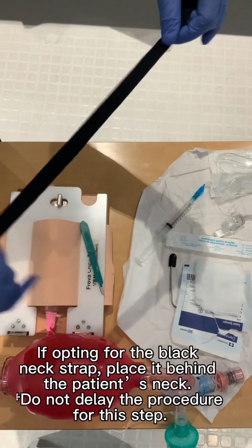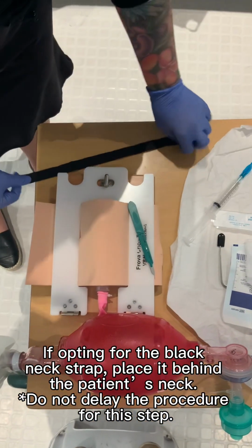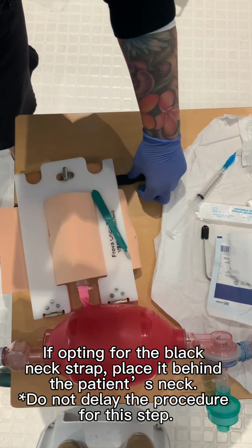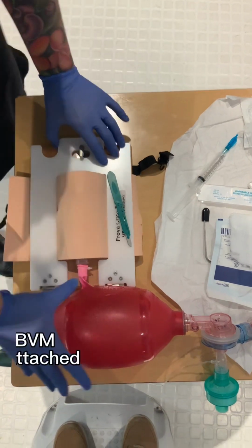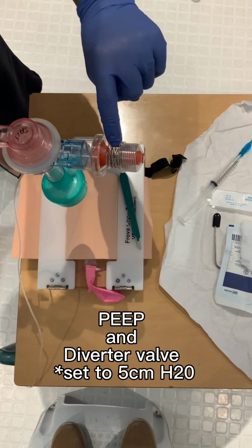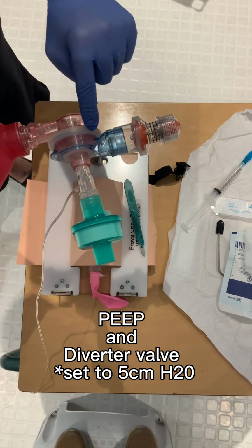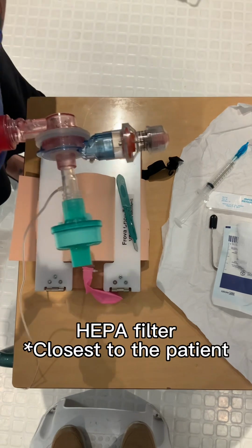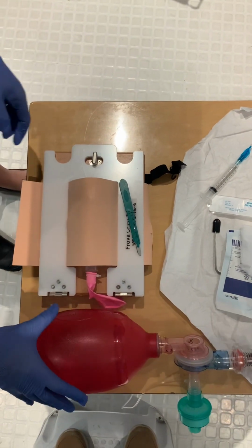A second option to tie the ETT down is the black neck strap. You can put this behind the patient's neck. Do not delay the procedure for this step. Check that your BVM is set up properly. You should have the PEEP valve set to 5 centimeters of water attached to the diverter, your ETCO2 filter line attached to the LP15, and the HEPA filter closest to the patient.